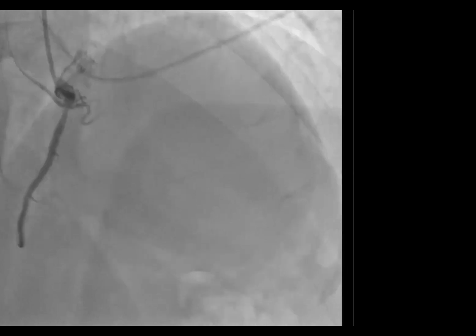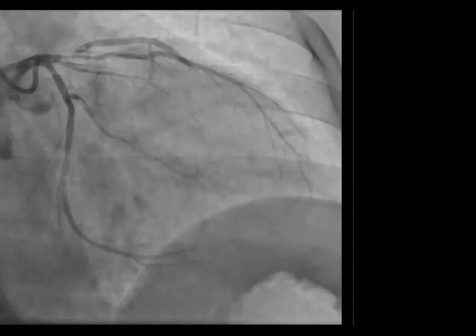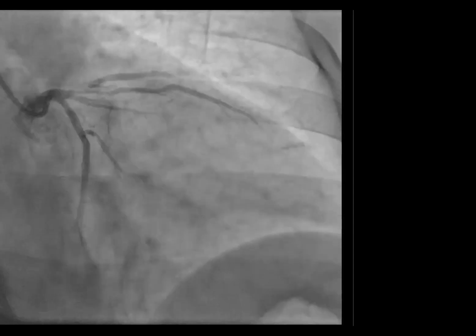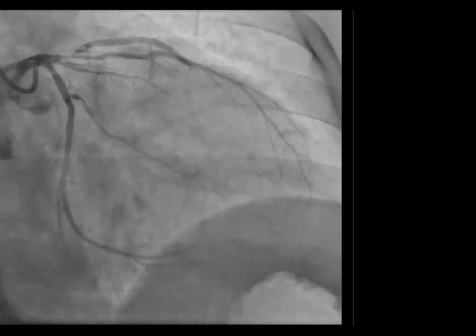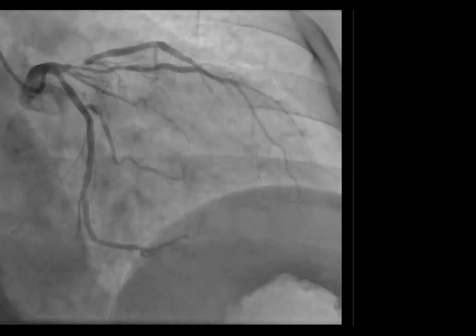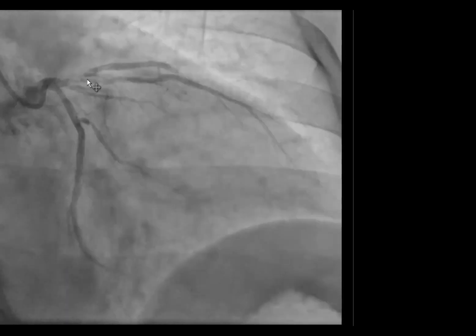This is the RAO view. You can see there's a significant lesion. You can see there is some lesion in the proximal LAD and there's almost a quadrifurcation of the left main. You can see there is circumflex coming off along with a high OM or a ramus vessel.